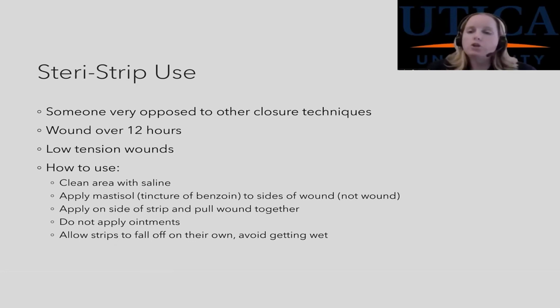And same thing, you don't apply any ointments, gels, lotions, nothing like that. It will dissolve the Mastisol in the strip. Okay. So no bacitracin, nothing like that. And then you allow the strips to fall off on their own, avoid getting wet. I usually will send people home with additional strips, so they can kind of like reapply it on their own at home if they fall off.